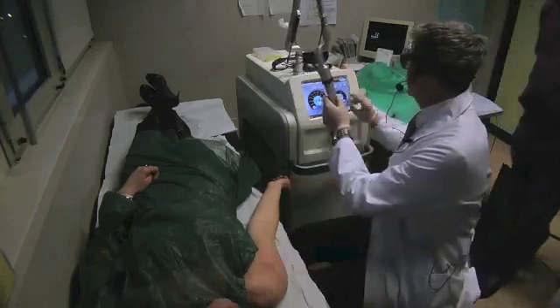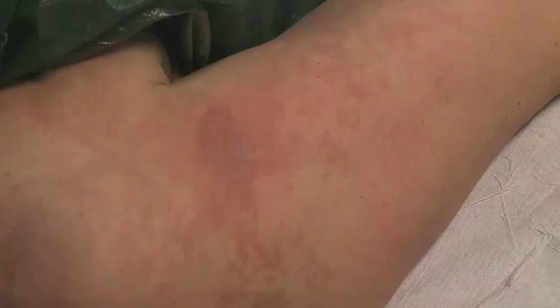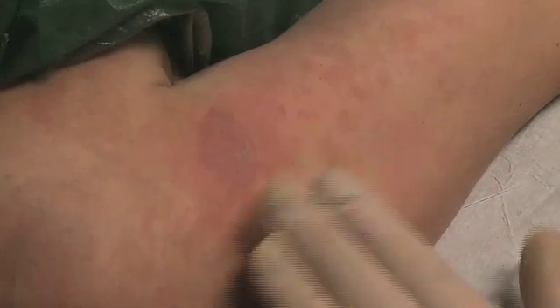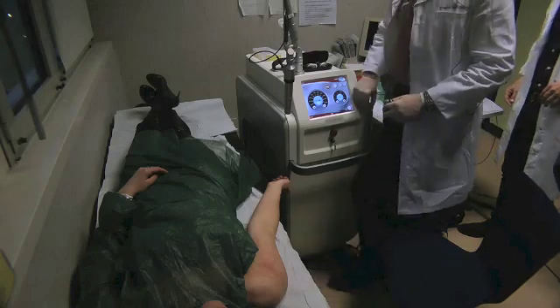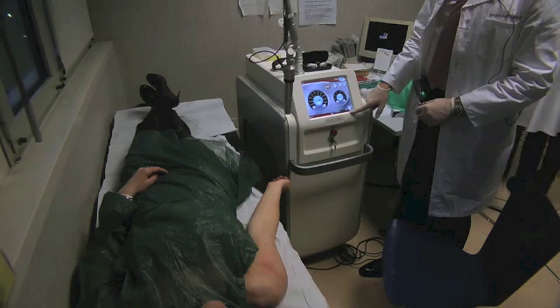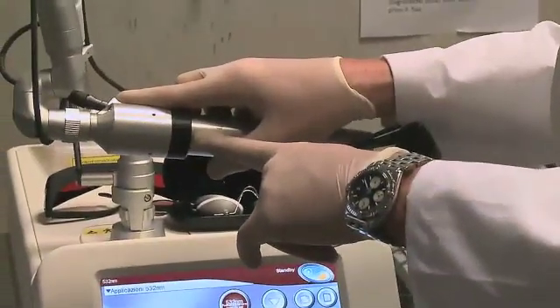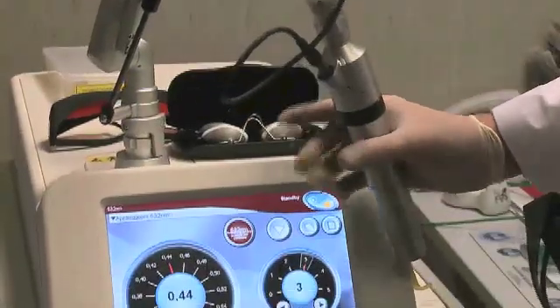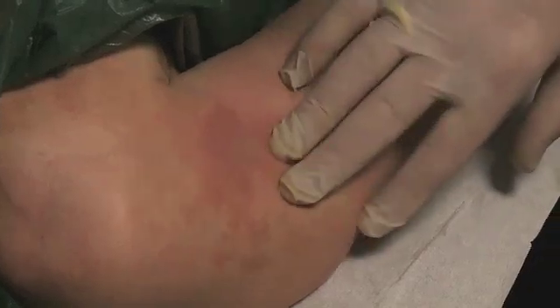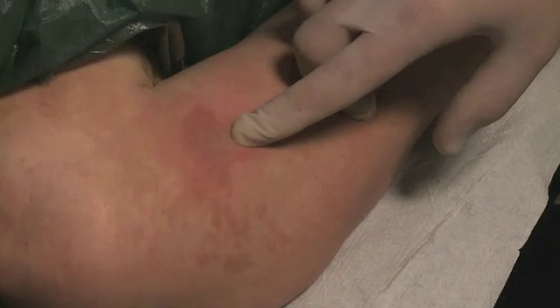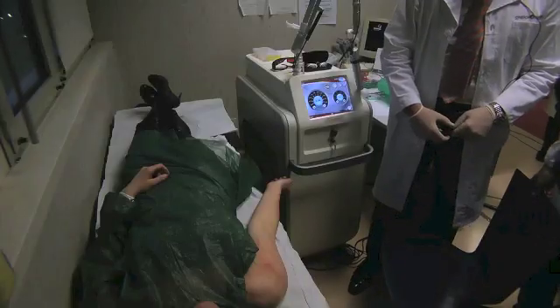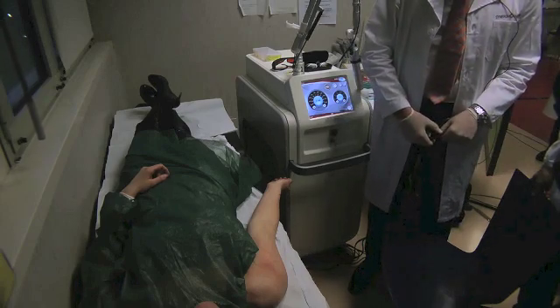Laser safe, and we have a close look. If we wait now for a minute or so, we see it turning red. We used 110 impulses with 6 mm spot size and fluence value 0.44. We see slowly increasing reddening and infiltration, but again no bleeding, maybe a few petechiae — no injury to the skin. When does she need to come back for the next treatment? In two or three weeks.